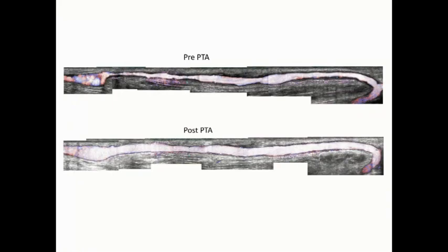Pre-PTA, post-PTA. This case has a very long segment of stenosis here and stenosis here. All the stenotic regions dilated after PTA.